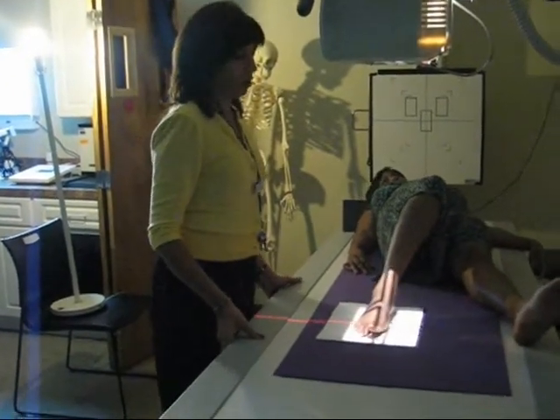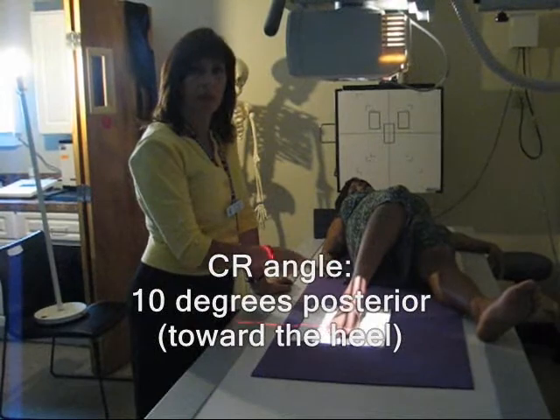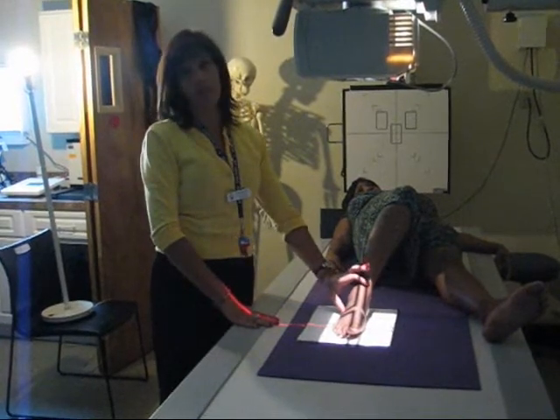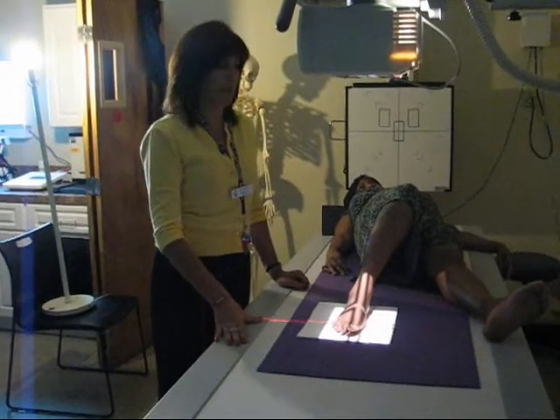The CR is going to have an angulation of 10 degrees towards the heel, or posteriorly. The reason for that is, as you know, the heel portion of the foot is thicker than the toe portion of the foot, at least for most people.